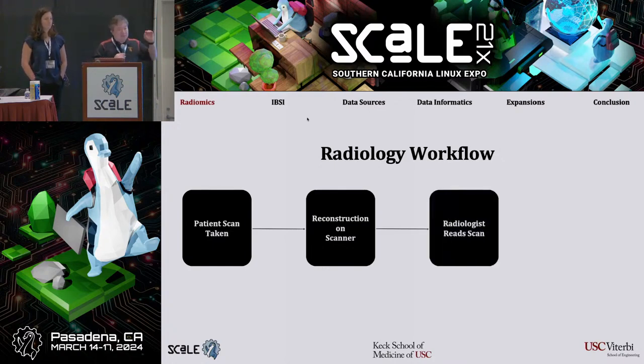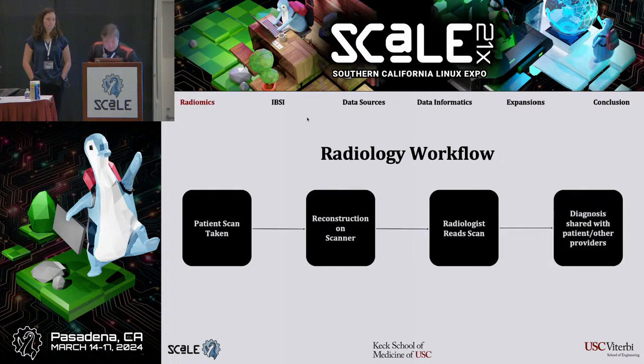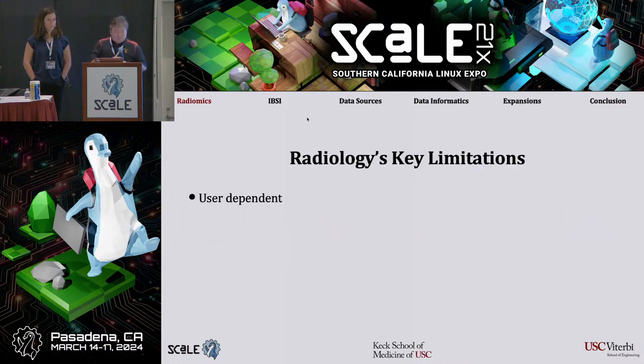That image is then given to the radiologist, and in general, the radiologist might do some little measurements, but most likely they're just going to do qualitative assessments. They're going to look at the image, dictate their impressions of what's going on, and that's the majority of the radiological practice as we do it today. Then finally, that diagnosis is shared with your referring physician, and they will plan your treatment off of that impression and summary. So radiology is very user dependent. If you get a diagnosis that is very severe or that you're questioning, get second opinions. That's all I'm going to say about that. It's very user dependent.